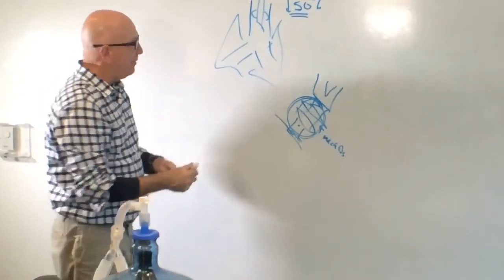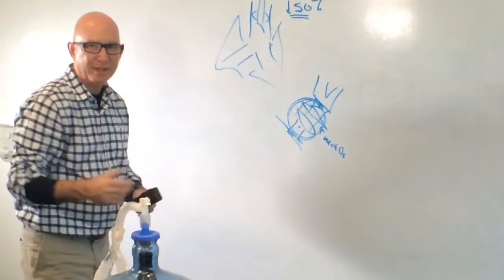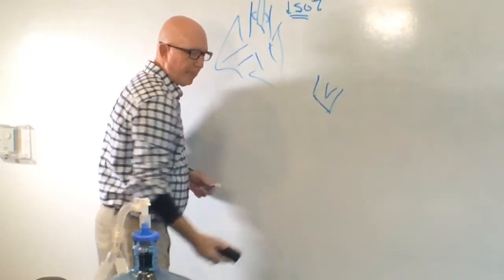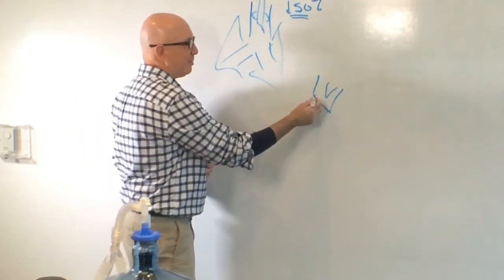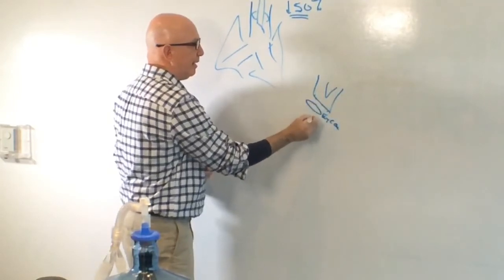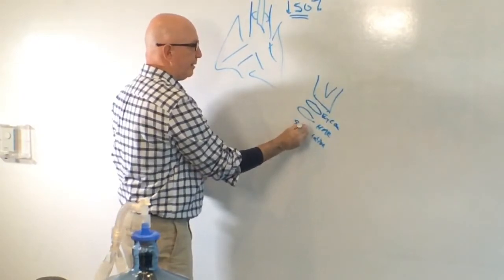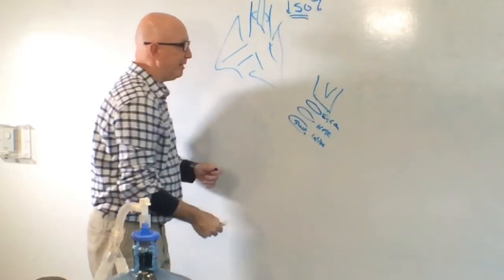Having said that, we sometimes use a number of different strategies to try to ventilate these smaller kids more effectively. So you can eliminate some of this mechanical dead space. Now, what you choose to eliminate depends on what you think is most important. So the end-tidal CO2 piece, the HME, or the inline suction catheter. And every time you eliminate one of these, you're decreasing the dead space.